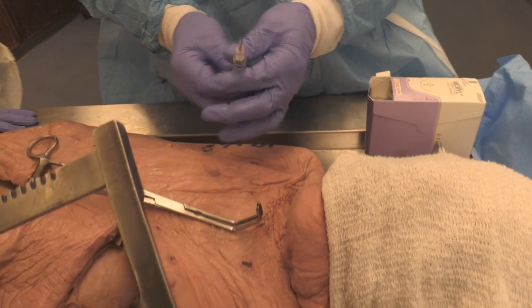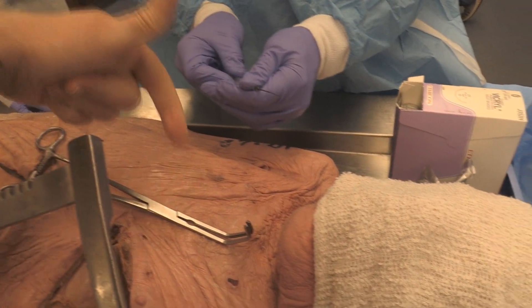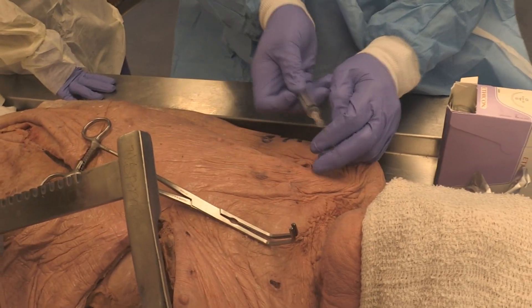Lining the bevel up with the numbers. As you line up with the numbers and go under, then you turn the numbers down that way.